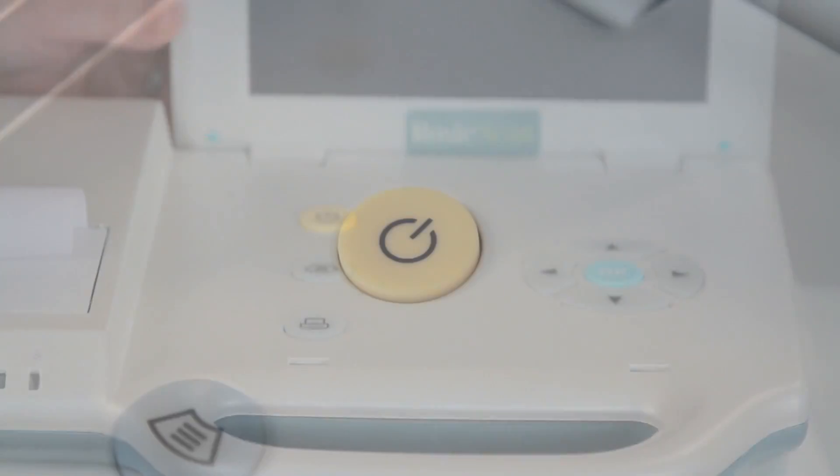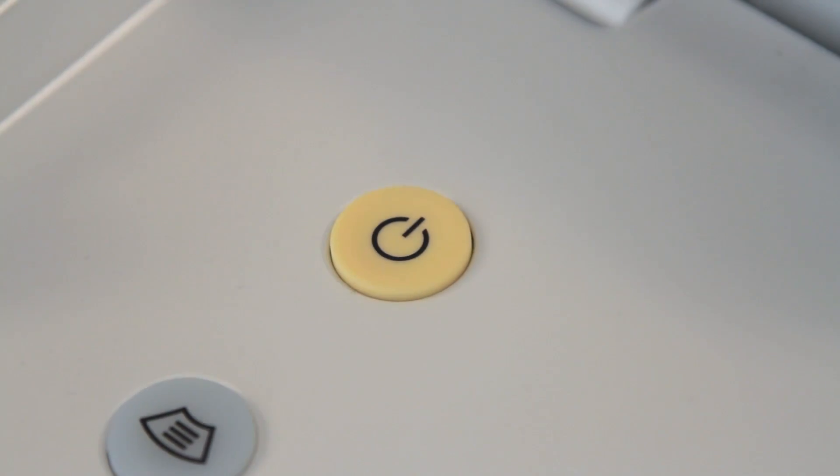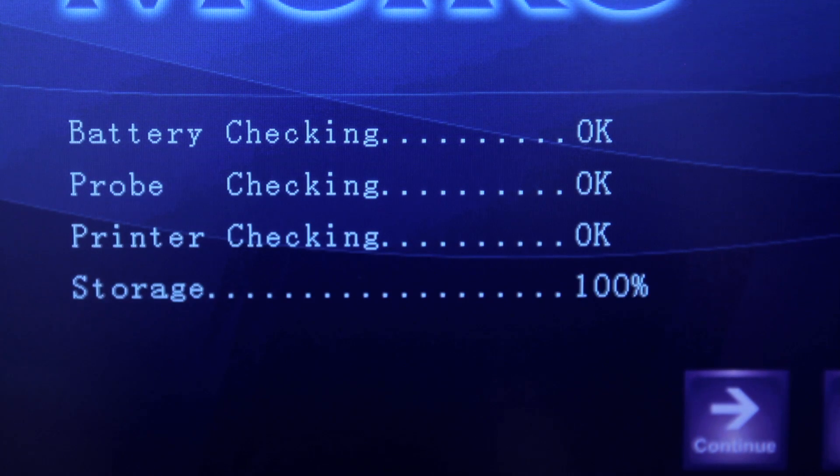To turn on the device, press the power key. The device will automatically check the battery level, printer, probe connection, memory capacity, and screen.